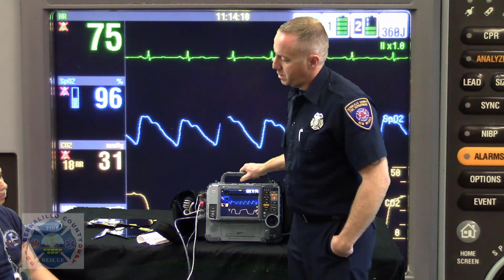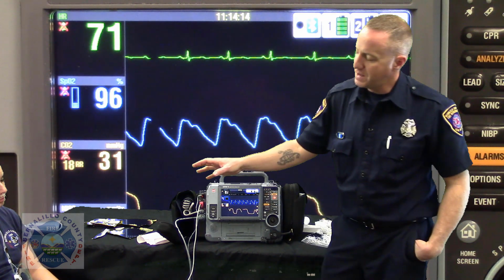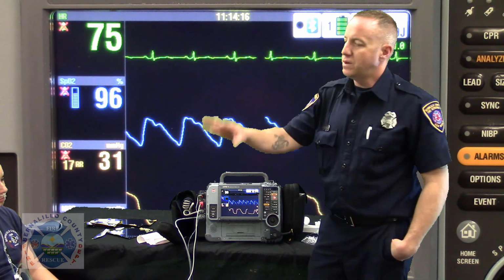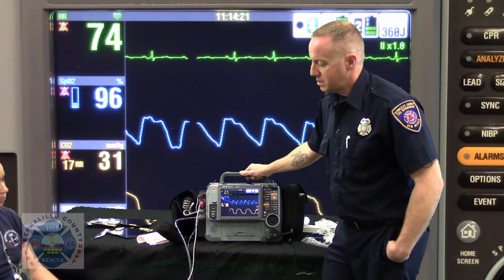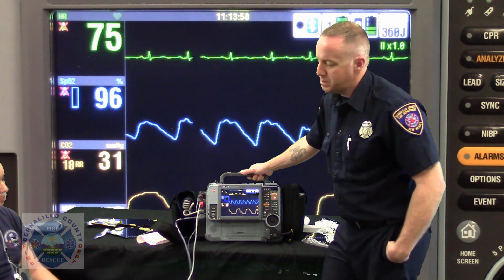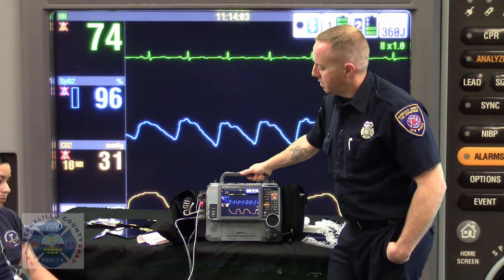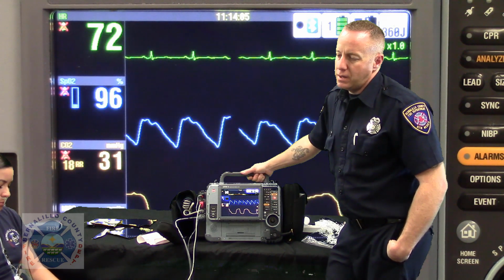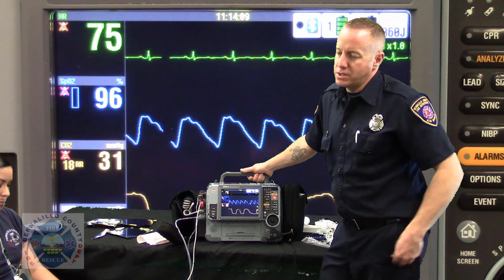The monitor's on the patient's left side. Everything's paying out to the patient's left side correctly so that I can do interventions on the patient's right arm. And we've made this entire interaction work very well for a very comprehensive assessment in a short amount of time. And if we decide to transition to transport, things are going to go flawlessly at this point. All because we made some very obvious considerations from the outset.